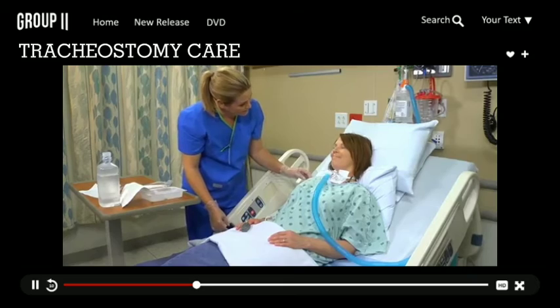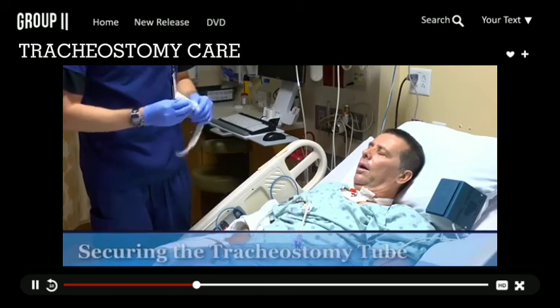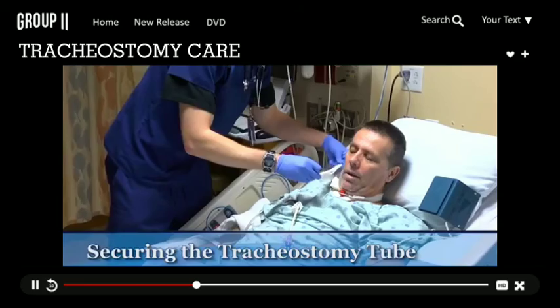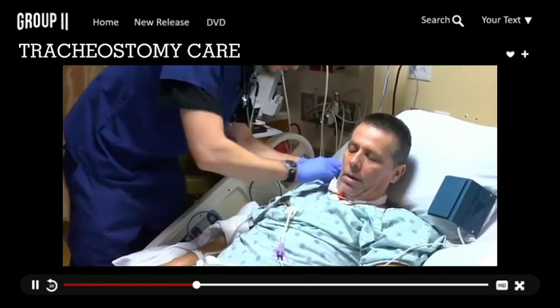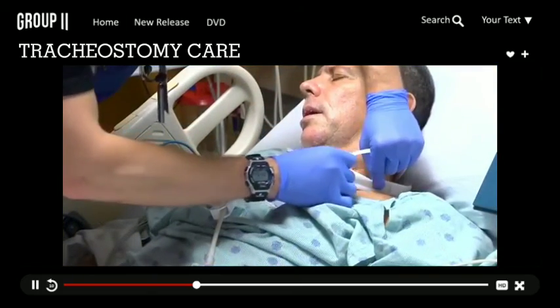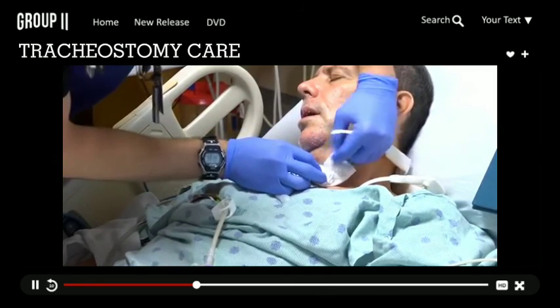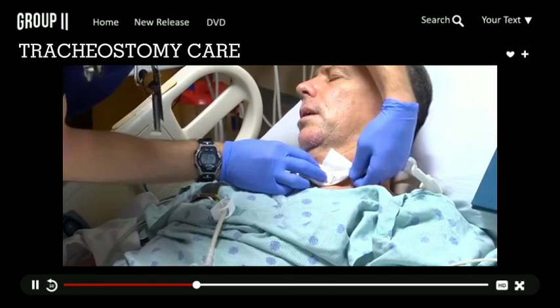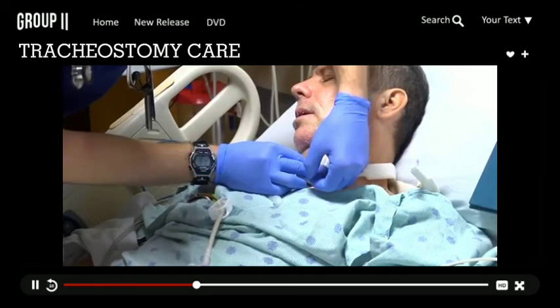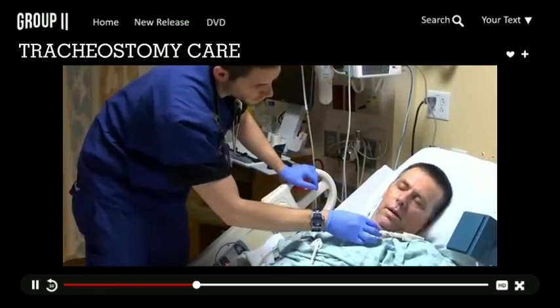Are you okay? To secure the tracheostomy using the tube holder method, you may want an assistant to hold the tracheostomy tube as you work. If an assistant is not available, leave the old tracheostomy tube holder in place until the new device is secure. Align the strap under the patient's neck. The Velcro attachments should be positioned on either side of the tracheostomy tube. Then place the narrow end of each tie under and through the eyelets on the faceplate and secure the Velcro closures. Does that feel okay?